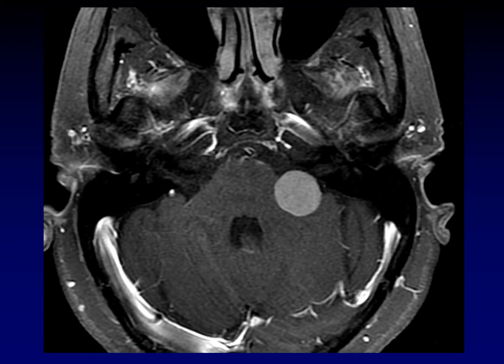It turns out that meningiomas can arise from ependymal surfaces. You're familiar with this because meningiomas are the most common intraventricular tumor. So you know that meningiomas don't need to arise off underlying bone. And that's the case in this particular example. This happens to be a meningioma of the cerebellopontine angle cistern, despite its spherical configuration. It's that uniform enhancement that is the biggest clue.